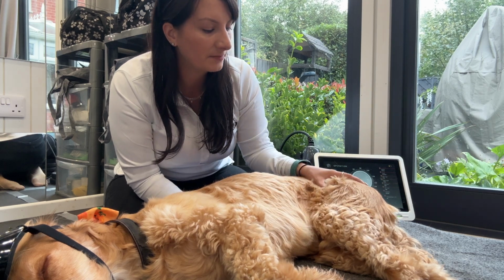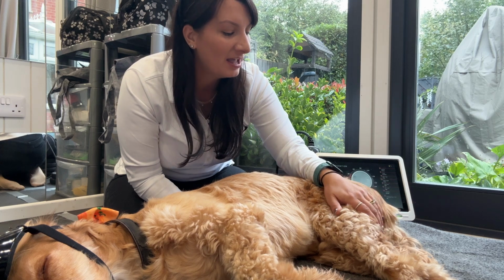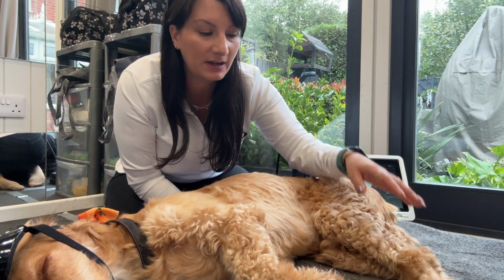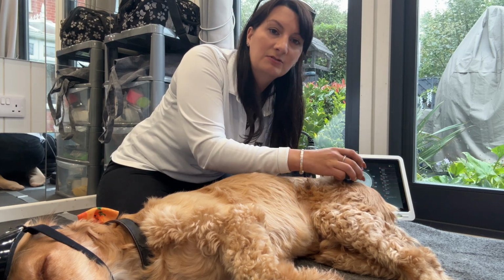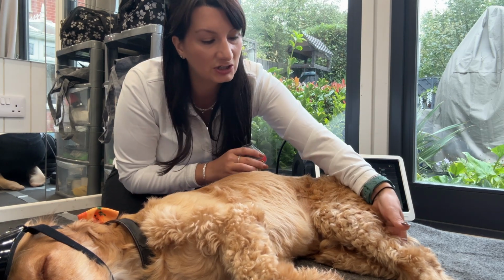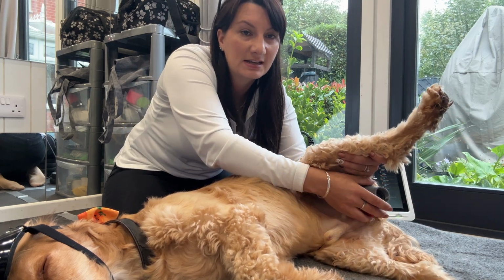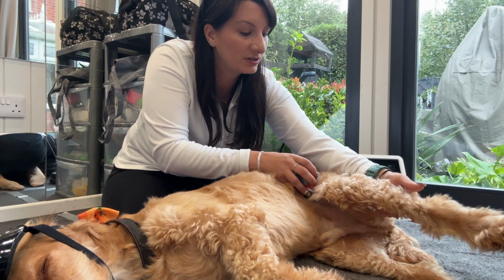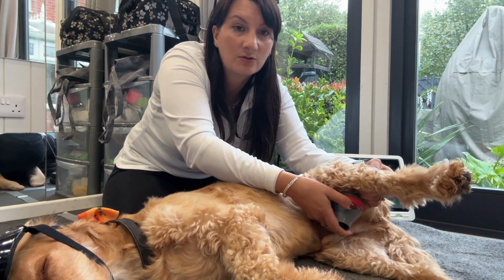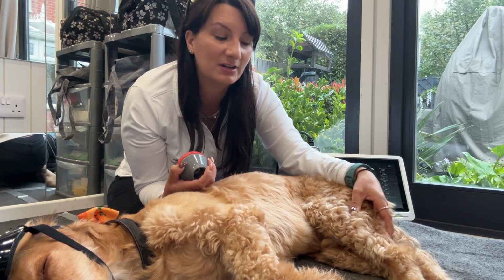Other things to think about when you are lasering, and I don't want to disturb Vinny now that he's gone to sleep, is that we shouldn't just be focusing on a lateral aspect. In the past I've seen people treat laterally, thinking that they're getting all that tissue, but actually lifting up and going 360 around the joint space as best we can, whether that's a hip or a stifle. Sometimes you find the better entry points are where you least expect it.